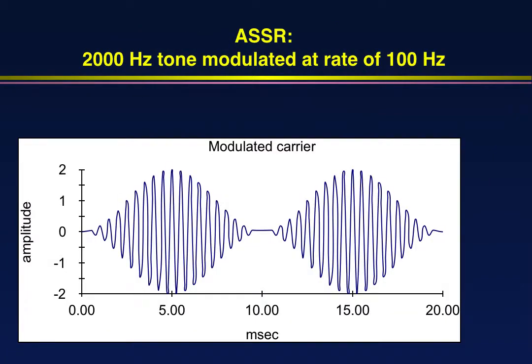Now we can get that information, of course, from tone bursts, but the problem with tone bursts, one minor problem, is that the output is limited because it's such a transient or brief stimulus. So most ABR systems do not allow us to get to intensity levels above around 90 dB, maybe 95 dB nHL with the very brief tone burst stimuli.